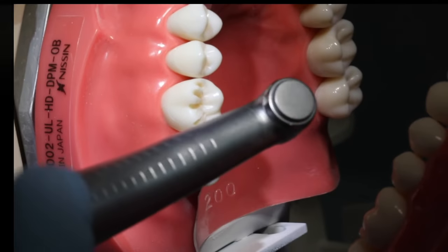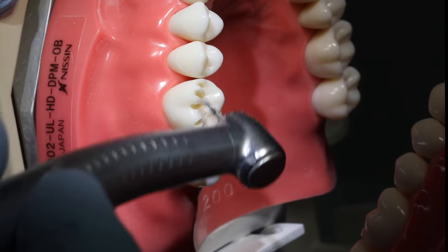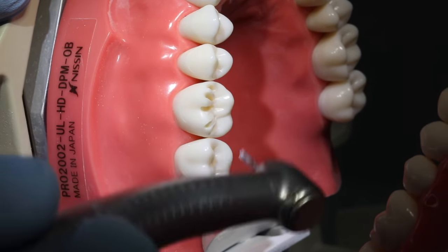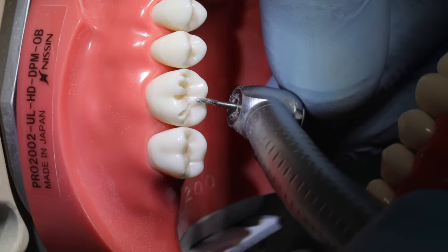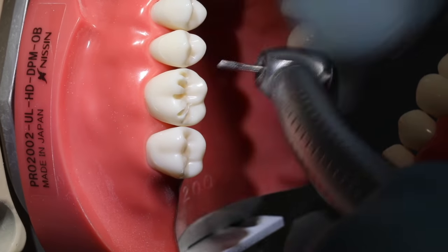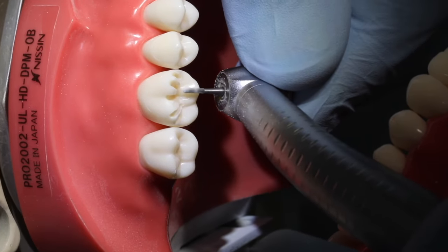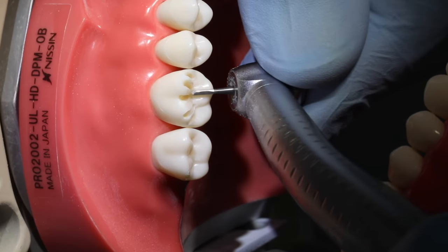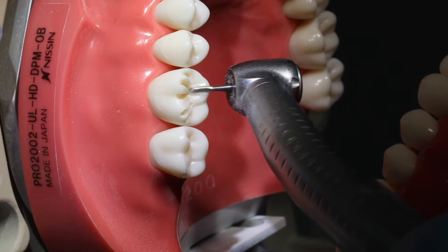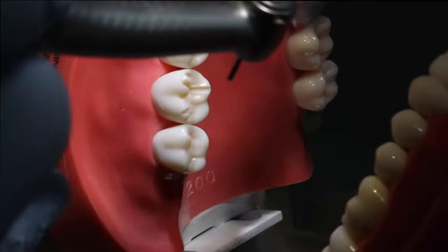On an upper first molar and an upper second molar, this large mesial lingual cusp actually takes up about two-thirds of that lingual surface compared to the much smaller distal lingual cusp, which is about one-third of that whole lingual area. And this part of the mesial lingual cusp ends up being quite a large flat area. So we'll prepare some guide cuts along that to help guide that shape. We'll start on the triangular ridge. And we'll have to come at this direction, like that. And we'll put another one toward the mesial marginal ridge.